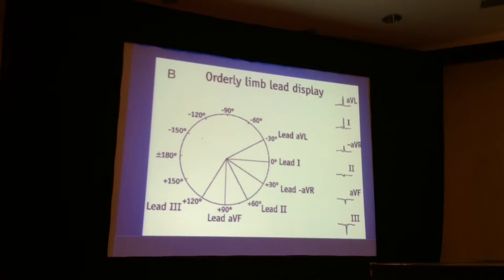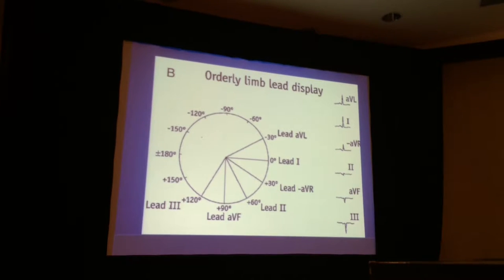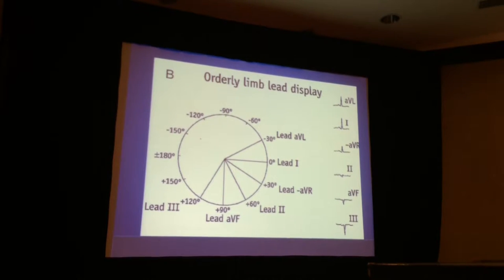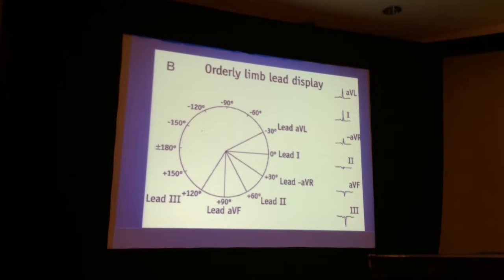In Sweden, however, they don't do that. From 15 or so years before I began working with Olle, they routinely went directly in a clockwise way from aVL around to III. And of course, you could go the other way, and some have gone the other way. But either way, it's this orderly sequence. And so one question is, is this just of equal value, and it really doesn't matter, and you're as able to make diagnoses on the ECG if you use one method or the other, and the orderly sequence doesn't matter? Well, a lot of the odyssey is Olle educating me that it does matter. Not only does it matter in making diagnoses on an individual patient at that time, but it matters in being able then to evolve.